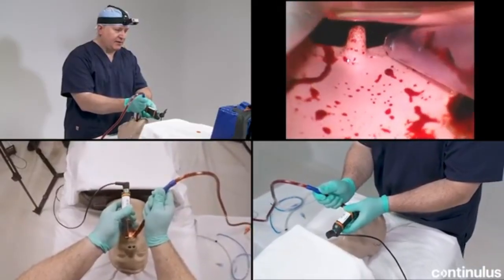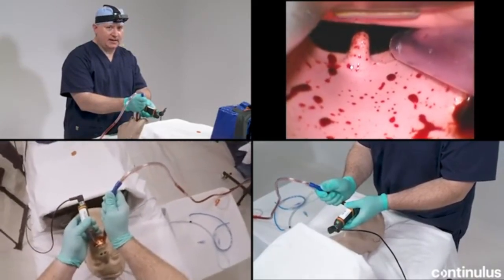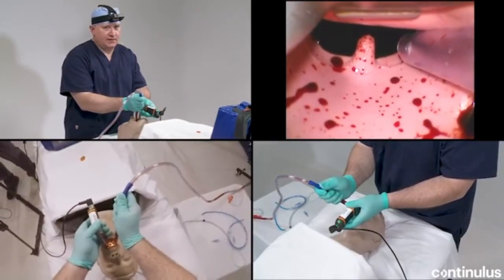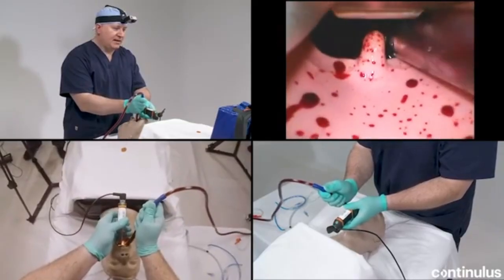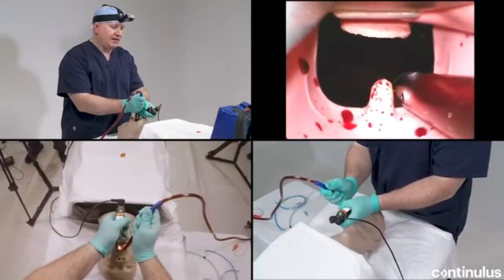I'm going to do this very, very slowly. Don't take this as the speed at which I would do this clinically. Obviously, I'd be doing this much faster, but how can you learn anything if I do this too quickly, right? So here we go. James has given me a couple pumps on the airway contaminant lever over there. I'm seeing the tip of the epiglottis.